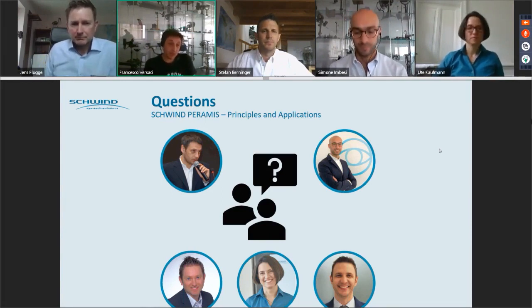Please remember that during the acquisition you can even blink. So don't ask the patient to be still like this, because you don't need to touch your patient. You can just allow the patient to blink, and this won't affect the measurement in any case.